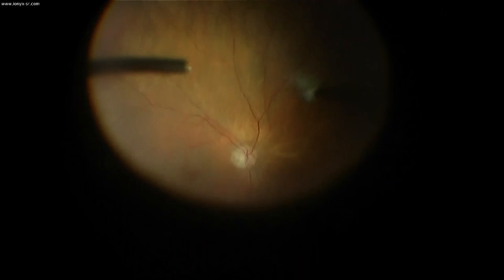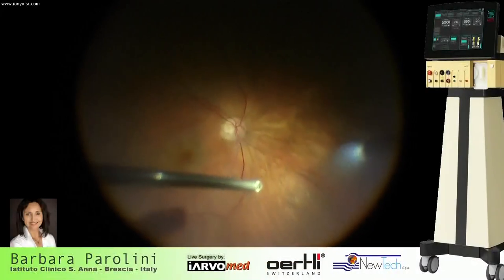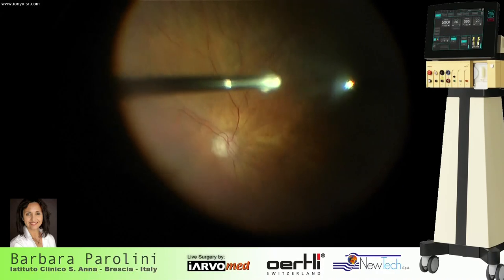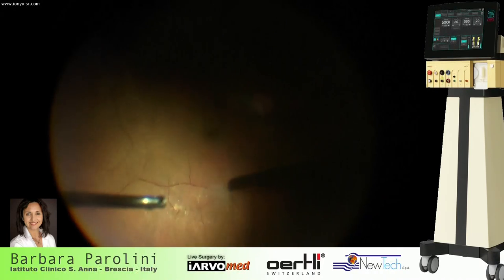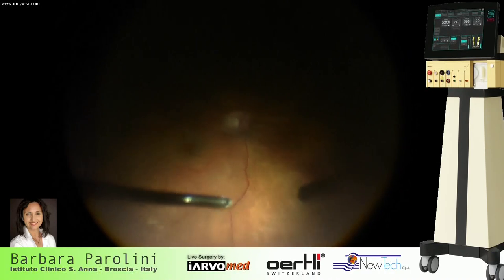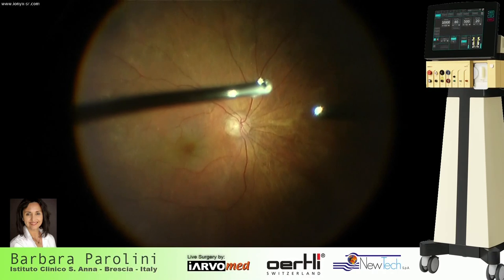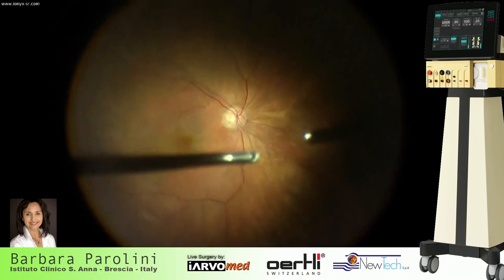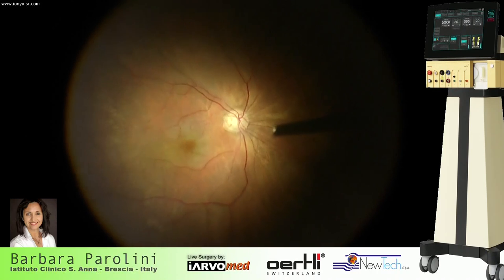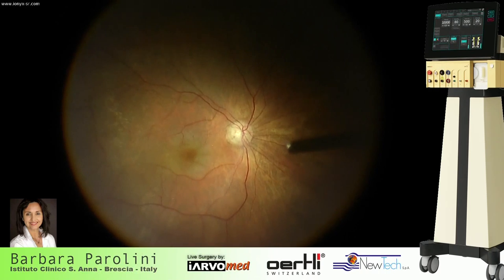So after performing the core vitrectomy, I will stain with triamcinolone. And then with a double dye, which is brilliant peel and lutein, to highlight a possible membrane on top of the papilla. It's not easy to see now, but it was possible to observe it at the OCT.